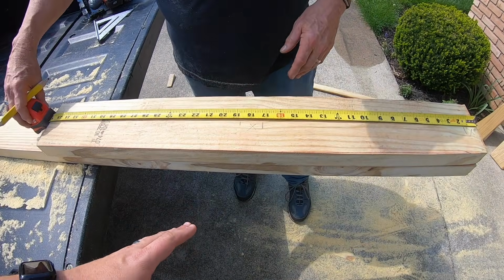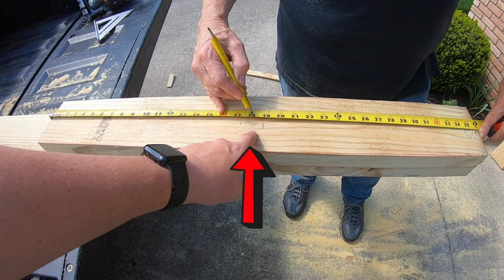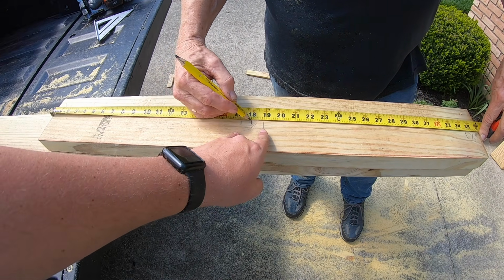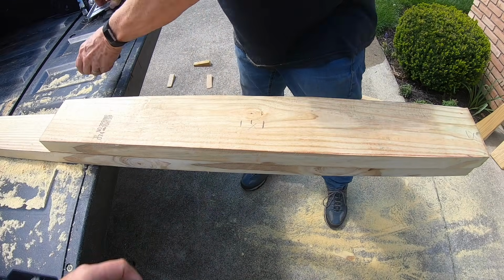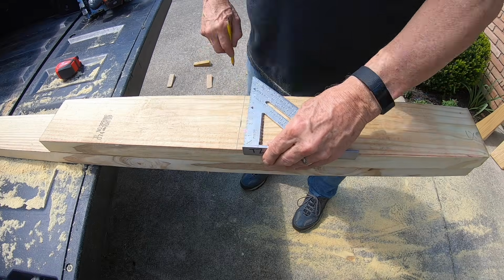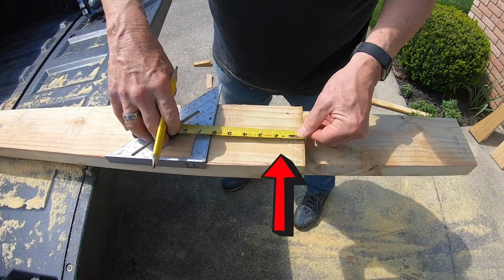So the next thing we need to do is go ahead and mark. This is our header board, and so you're gonna go ahead and mark 18 inches, which is halfway, and that gives you your X, which is where you kind of want it. Then you're gonna go 3/4 of an inch on both sides right there, and that will give you the ability for your board that will sit right there, and you can go ahead and mark that. That will just help you get nice and lined up. Then kind of the same thing for the end down here. You're gonna mark 1.5 inch.